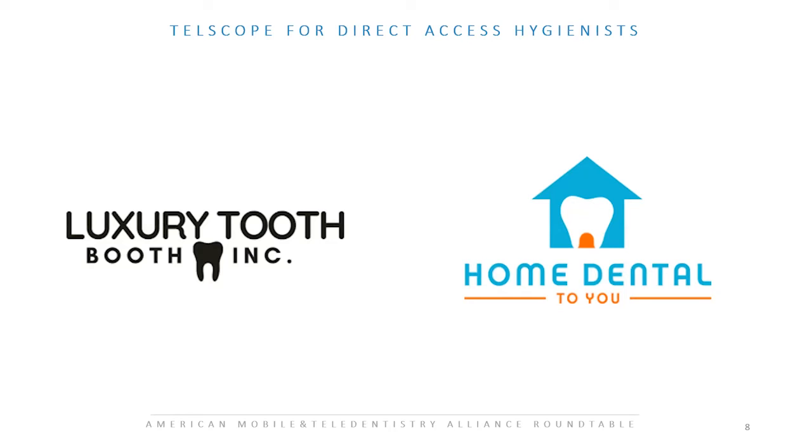And Teledentix really rose to the occasion by making it so that we did not need to be connected to Wi-Fi, which can be very challenging and difficult in some situations. And moving on to the next slide.